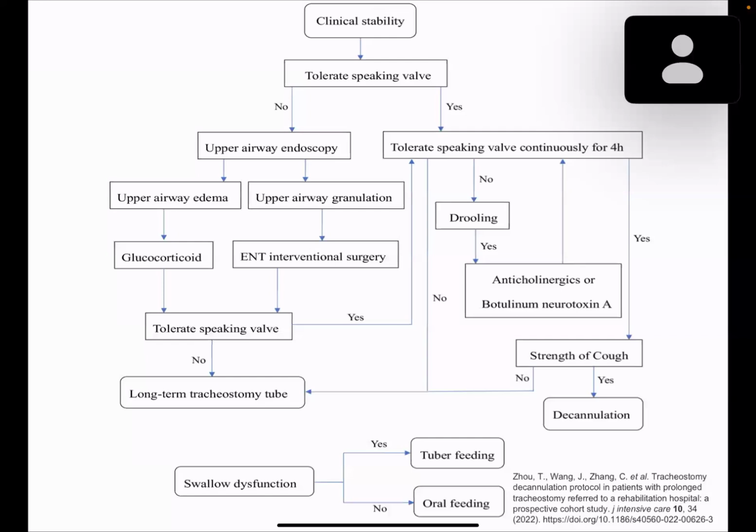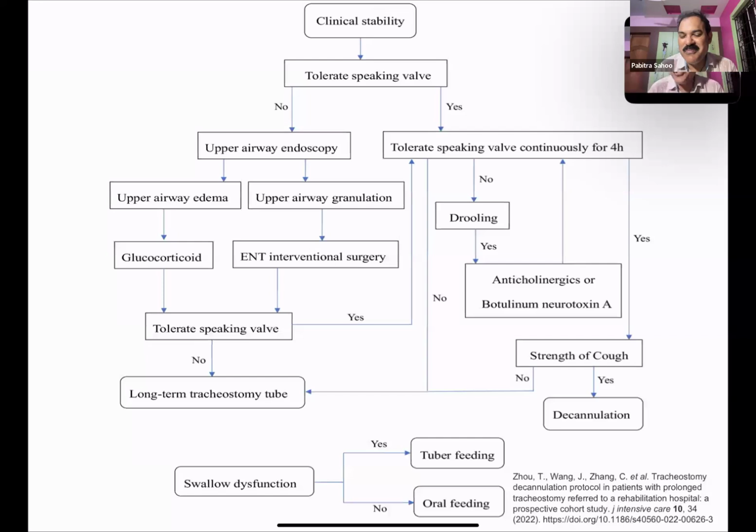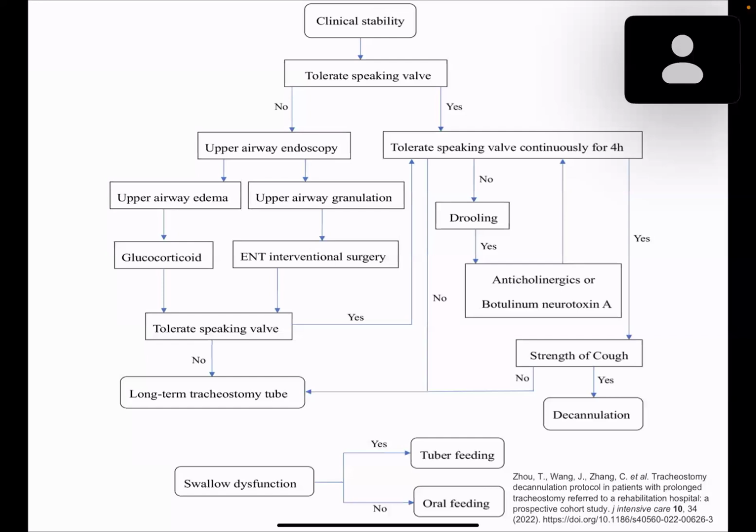Abhishek, do you reuse the metal tracheostomy tube? Yeah, we give two sets of tube to the patient, and they take out the outer lumen every 7 days, and the inner can be taken out every day. So they keep it clean. There is a cleaning protocol for the tracheostomy tube, and they keep on cleaning and boil it and again reinsert it. The infection rates are pretty low, and in Portex you can't do all this.